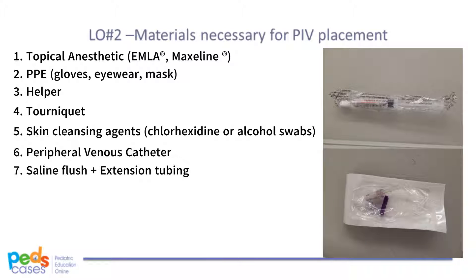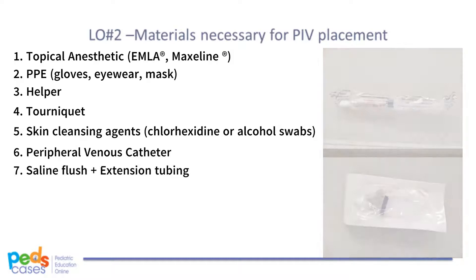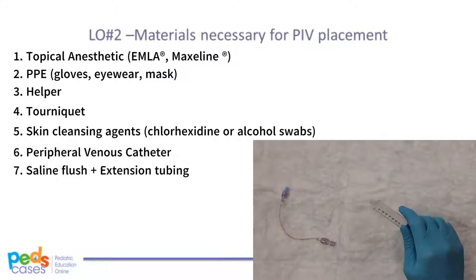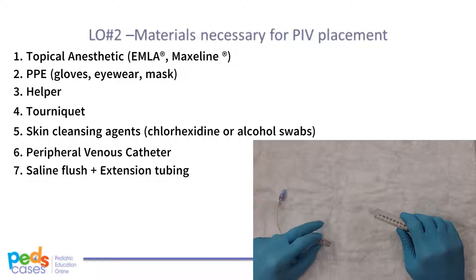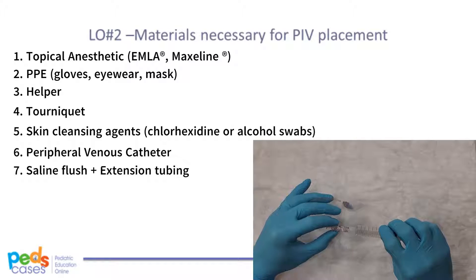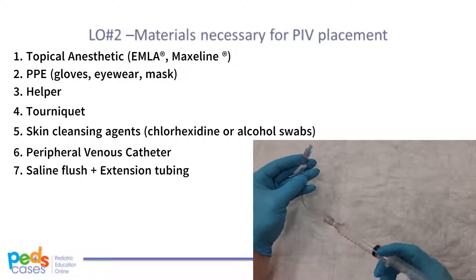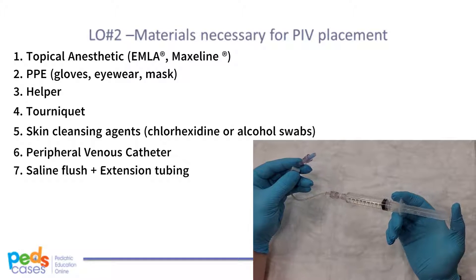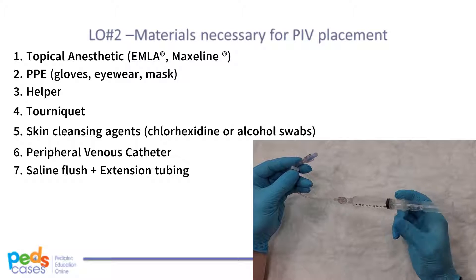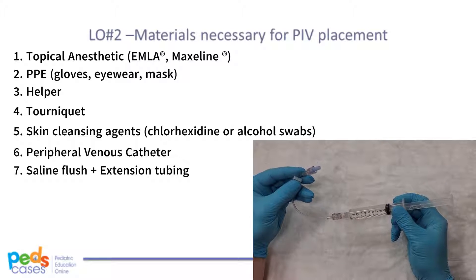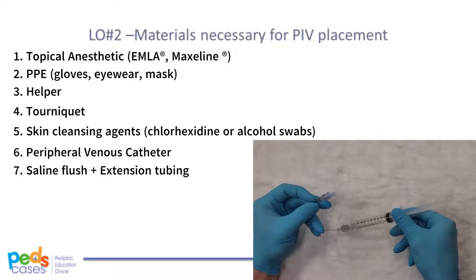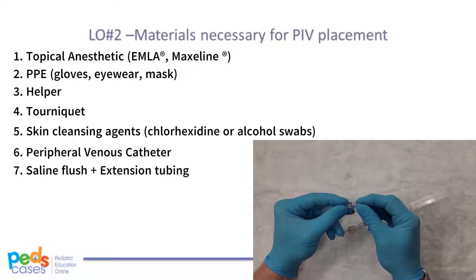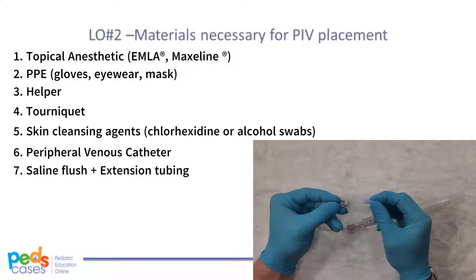Seventh, a saline flush and extension tubing. To prepare this, take a 10cc syringe filled with isotonic saline, sometimes prepackaged as a flush, and the extension tubing. Attach the extension tubing to the 10cc syringe and prime the line by pressing fluid through to the end of the extension tubing to ensure there is no air that can inadvertently be injected into the patient. Unless you have a helper, it is important to do this step now while you have both hands free. For sterility purposes, ensure that you keep the cap on the end until just before you are ready to connect your IV.